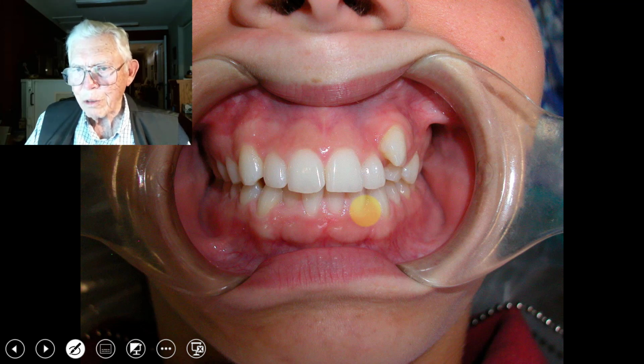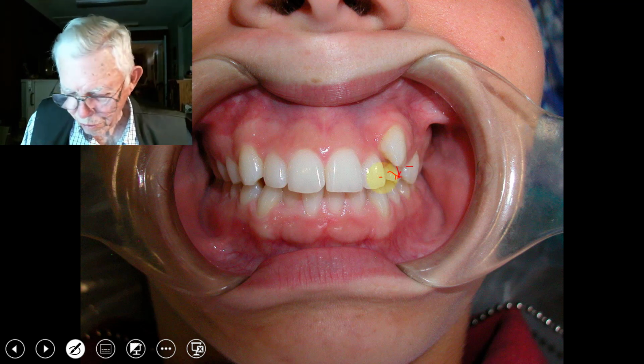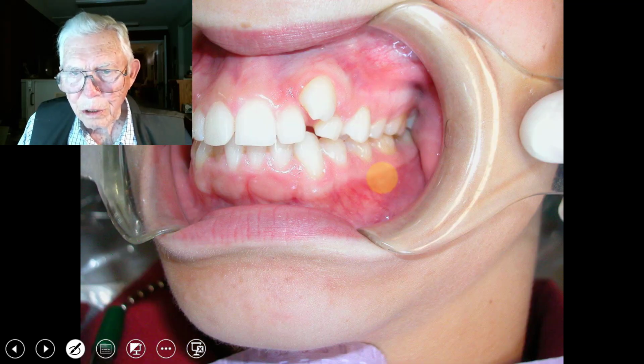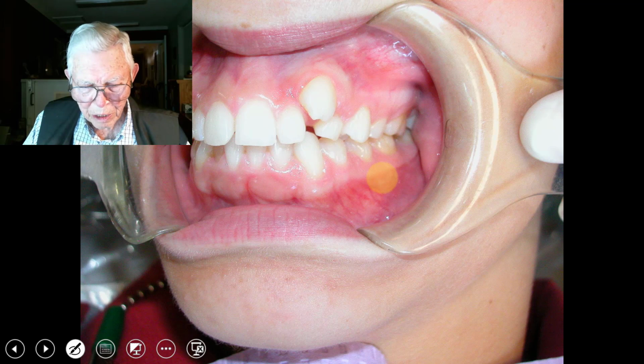Now we've got a cuspid that looks pretty bad, but it's not. That's a deciduous tooth right here. Every time you take that out and you open a little space, you can bring that cuspid in easy. It might be slightly fuller, but not much. You've got pretty much room there that you could get the tooth into without messing the face up or making it any more protrusive than it is.